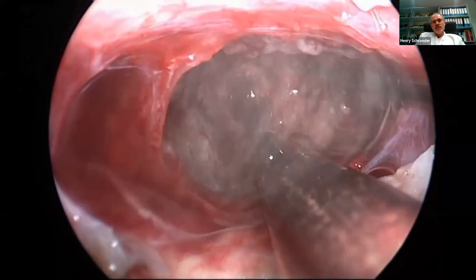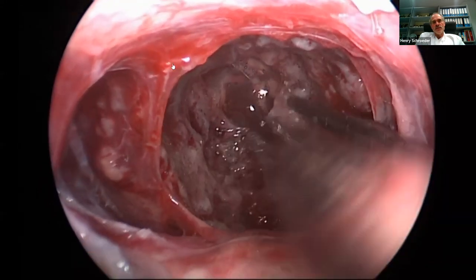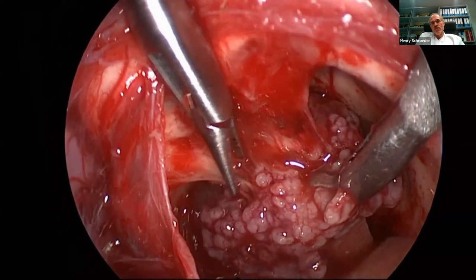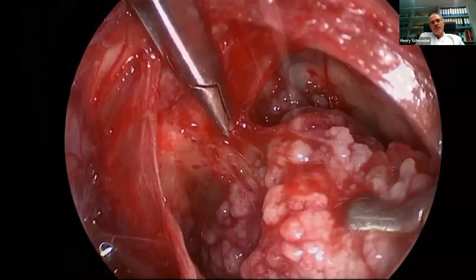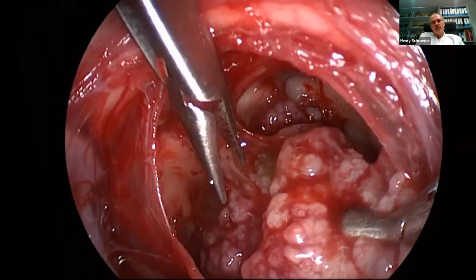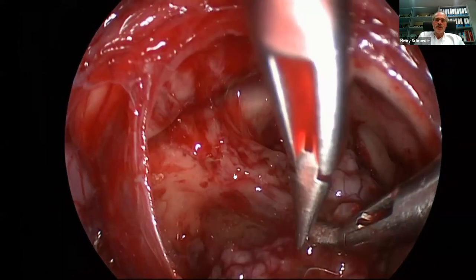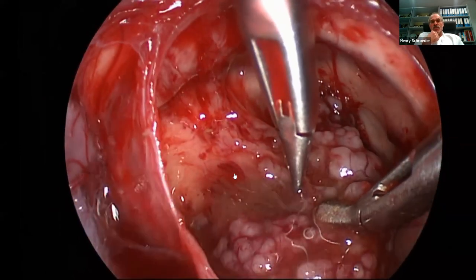Debulking of the tumor with ultrasonic aspiration to get some space. And then here, this is all normal infundibulum. So it's an intra-infundibular tumor. And you see the tumor is not coming down. So I use a 45-degree endoscope, traction, counter-traction to dissect the tumor. And you see I don't end up in the white hypothalamus. It's always a gliotic yellow plane. That's why I resected the tumor, because I did not end up in the white hypothalamus. If you see white tissue, I would stop. Otherwise, the patient might get hypothalamic damage and become obese.